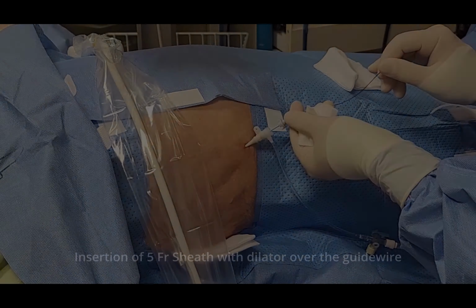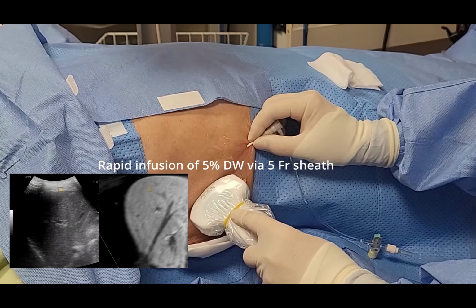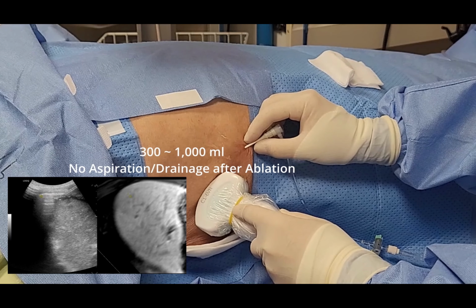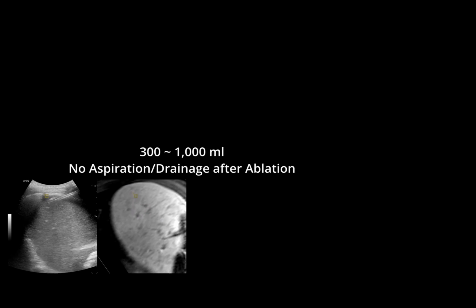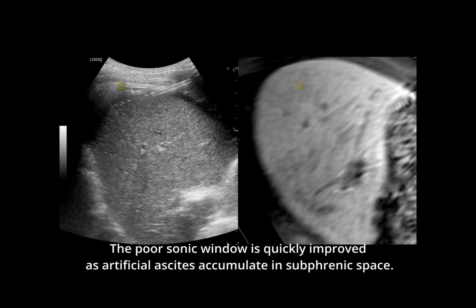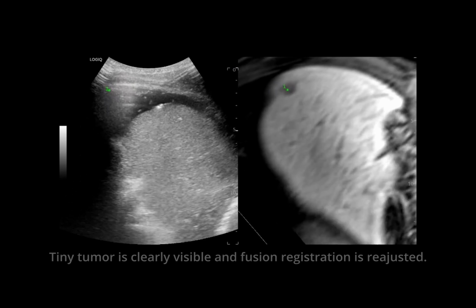After removing the 7 French dilator, you can see the 5 French sheath in the peritoneal space, the right subphrenic space, not the subhepatic space. And after full dripping up to 1 liter, you can see the separation of the liver from the peritoneum, as well as the conspicuous lesion getting increased. This is one clear reason to use artificial ascites: to improve the sonic window.